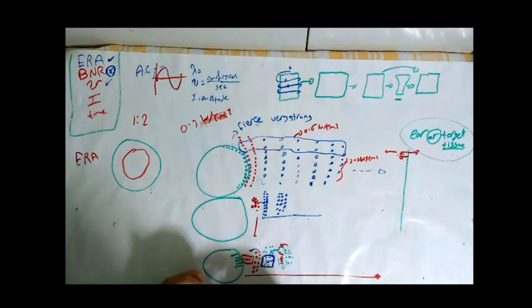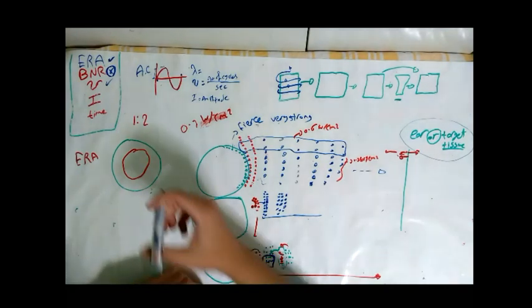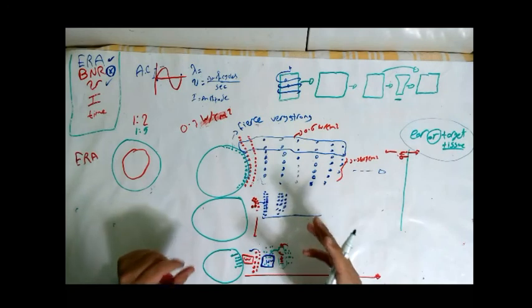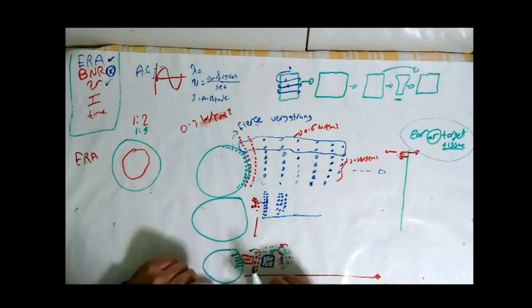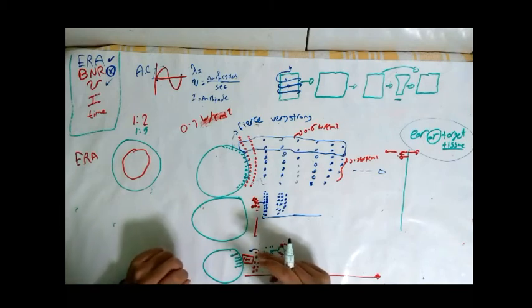So it is very safe to use a panel with a beam non-uniformity ratio of up to 1:5, because more than 1:6 will limit you from using high intensity during ultrasound therapy. A 1:8 ratio is unsafe. So if you are buying a device with a 1:6 or 1:8 panel, I suggest not buying this device, because it will limit you from using high intensity current.